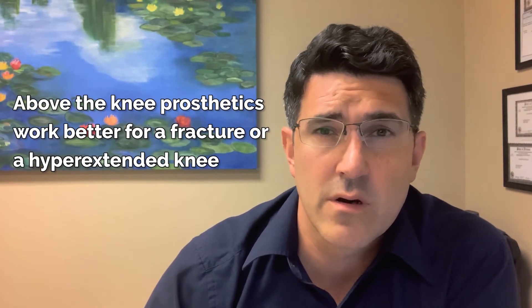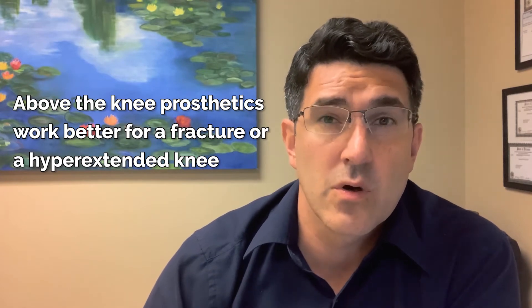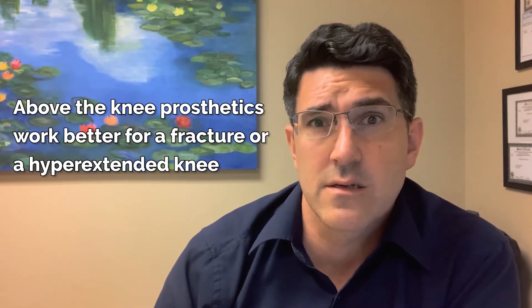As one of my teachers used to say, you stay below the knee whenever you can, but sometimes you actually have to go above the knee — for a fracture, for example, or a knee that's just really hyperextending. Like a polio patient sometimes might have a knee that snaps back and really needs that extra support. So that's when you would use a K-AFO.